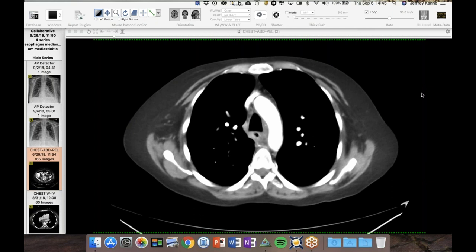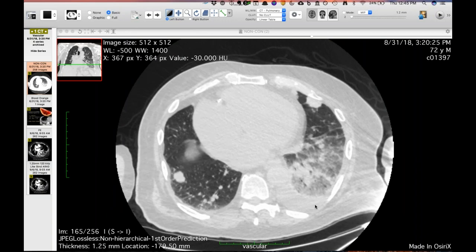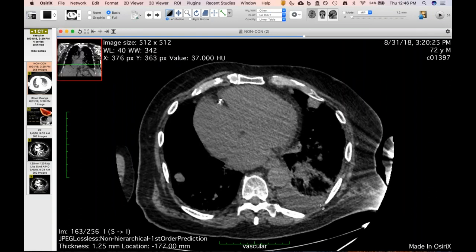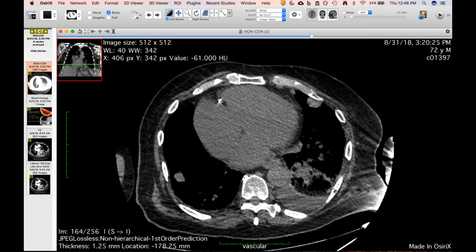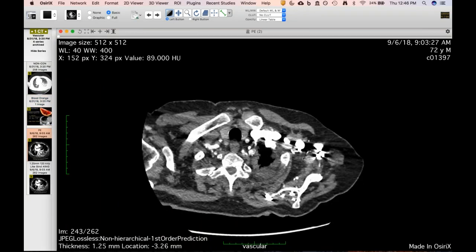To reinforce the PE infarct case: the key finding is that rind of higher attenuation — the blood orange sign — with pulp in the center. This is why it looks like an infarct and how it's confirmed. Always think about infarcts in cases like this rather than automatically calling it pneumonia or something else.